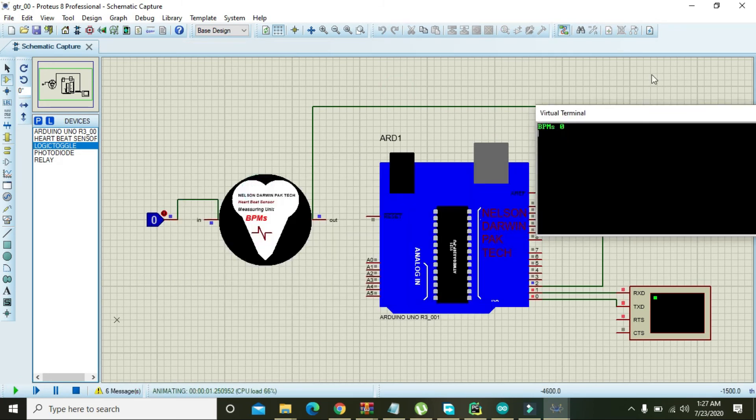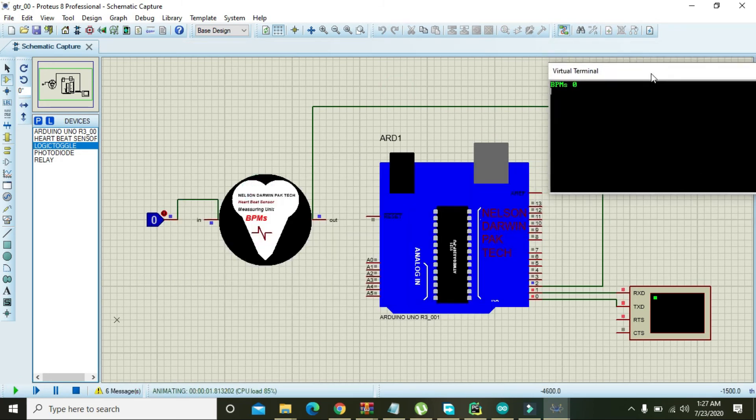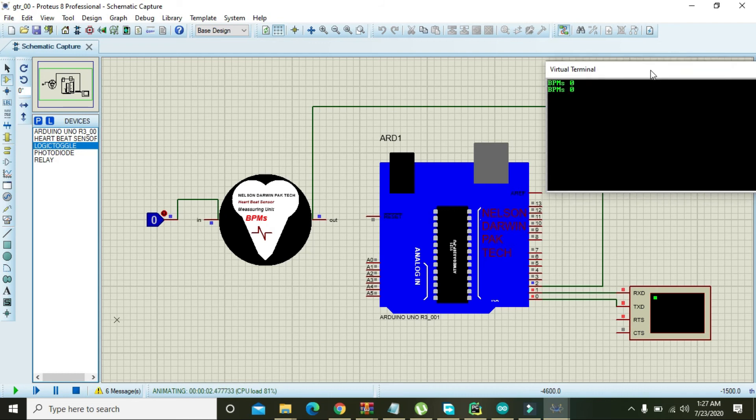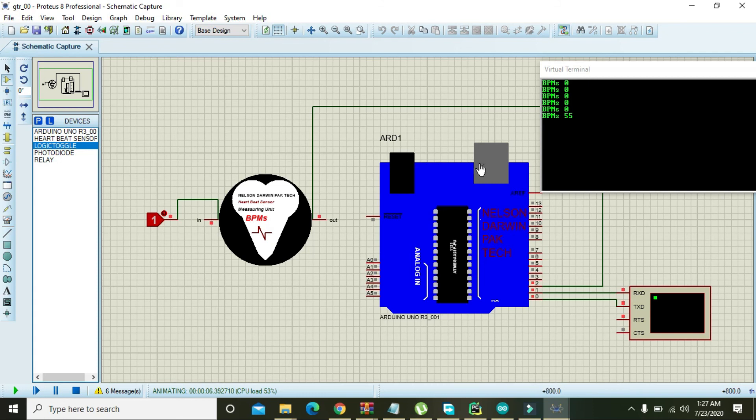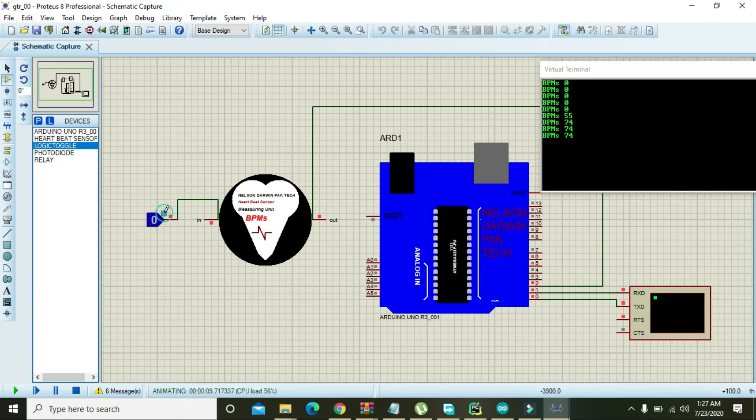And here we can see that BPM, it is showing BPMs, and BPMs are zero at that moment. But when we make it on, that is our sensor is on, that is showing BPM 55, then BPM 74 and 74 and so on. Again you can turn this off.